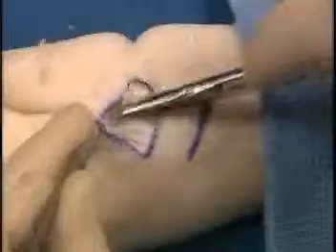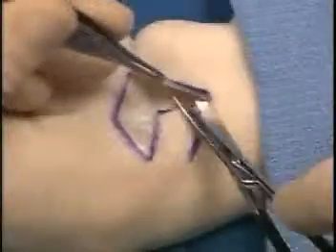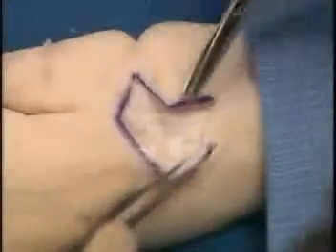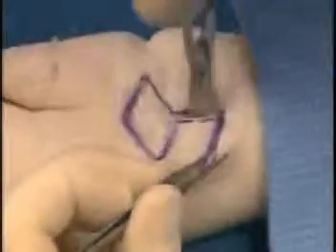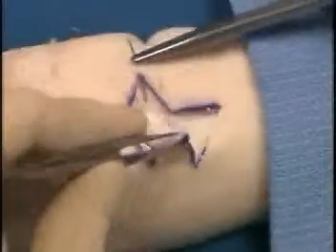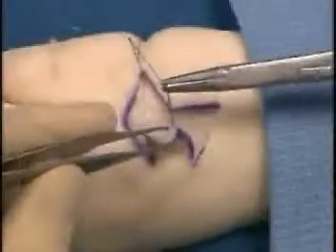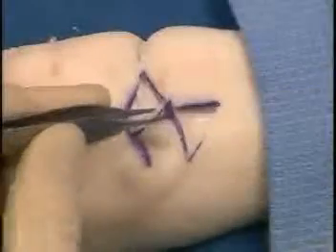You want it widely undermined so that the flap will be rotated into position so that it is not under any extreme tension. Notice the wide undermining in this particular case. Once the flap and adjacent tissues are widely undermined, then the flap is rotated into position. The point of maximal tension of the flap here is seen with the first suture.